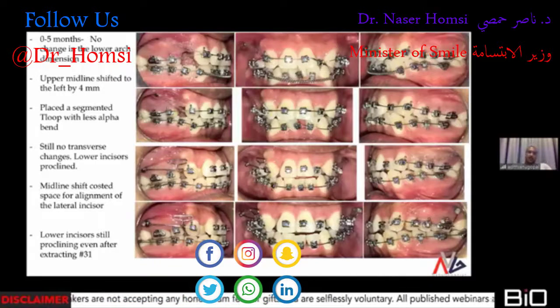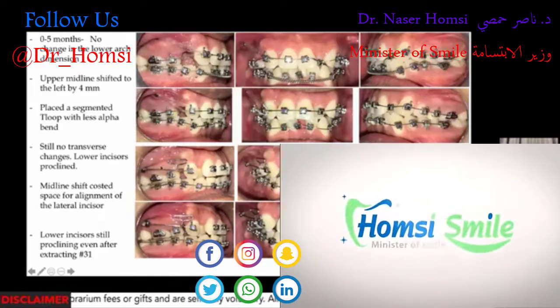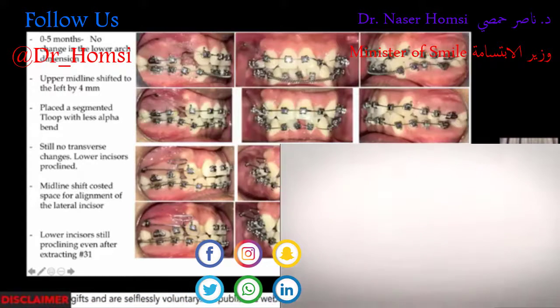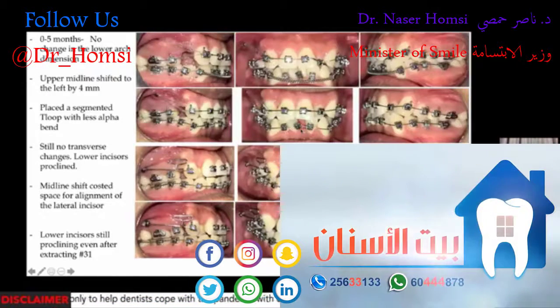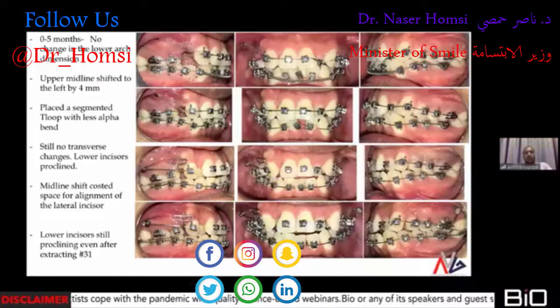And then finally, I had to resort to a T loop over here, and I had to get the canines back, and I had to now change my entire treatment objective, because I was not able to control the lower proclination. So I had to extract the lower incisor over here, because I had promised the patient that I wouldn't be extracting any other tooth except for the 1-4. So I couldn't just jump the gun and say that I have to extract all 4 premolars in this particular case, which was actually my mistake.